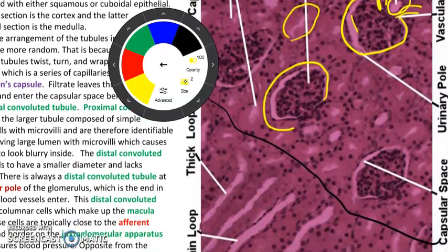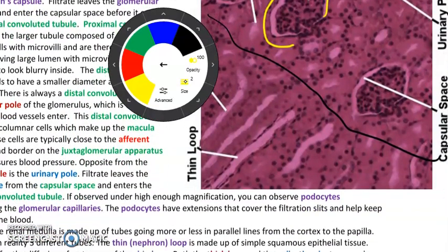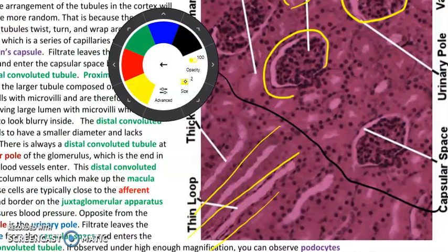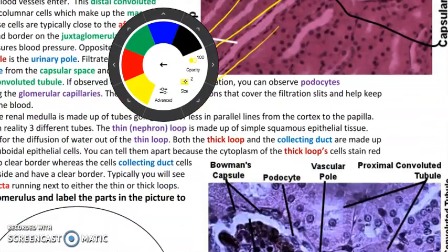And then we have the medulla. The medulla histology is very, very boring. This is what the medulla histology looks like. It's big, long columns. And that's very, very boring. You're going to have cuboidal, simple squamous. But we're going to draw the cortex.